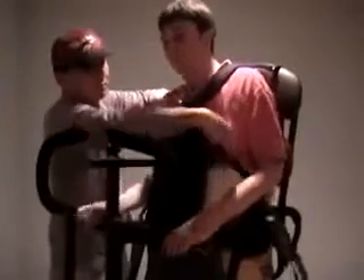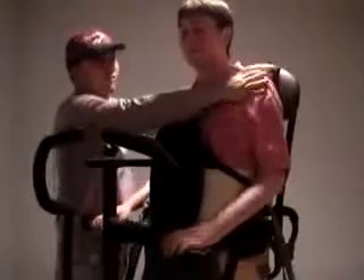Once in a standing position, position the necessary accessories that will allow you to feel more comfortable and to be able to operate the standing frame in a safe and comfortable way. For myself, it involves putting a chest harness that will hold my upper body closer to the back of the standing frame. I also like to have hip guides which keep my hips in place so that I am in a straight standing position and can glide without worrying my hips are going to move out of place.